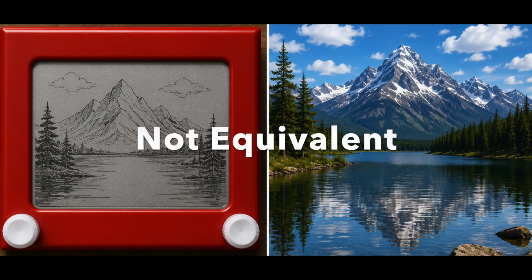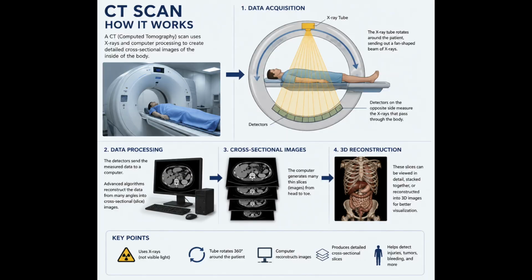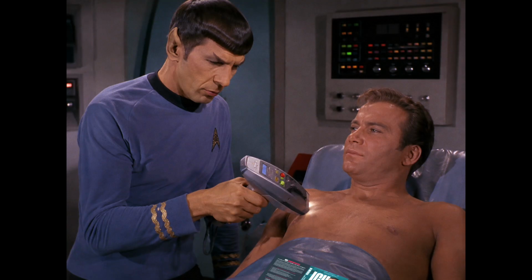It is important to note that an x-ray will only give you so much information. It can show you big problems and major abnormalities, but typically does not give you that level of detail that may otherwise be required. Other tests like CAT scans, which are a collection of x-rays taken at different angles, MRIs, ultrasounds, and other imaging tests can reveal significantly more information.